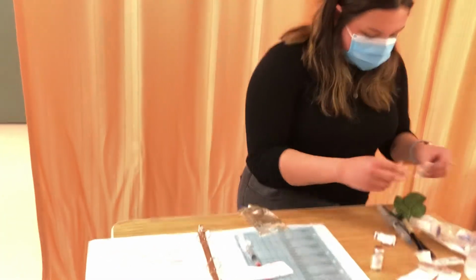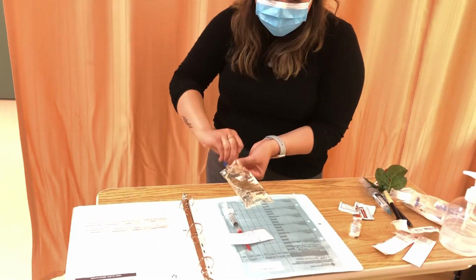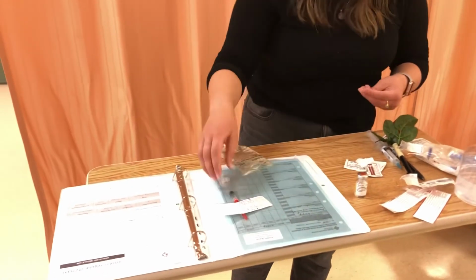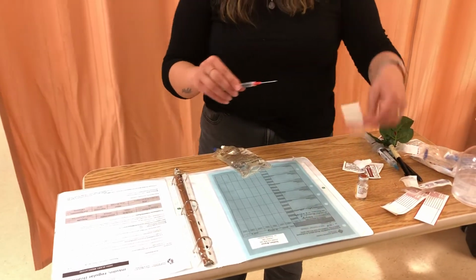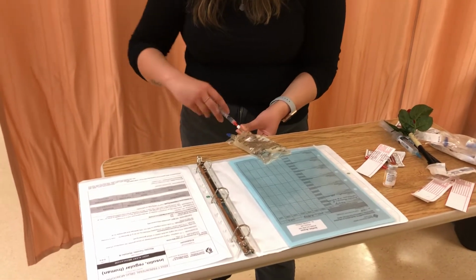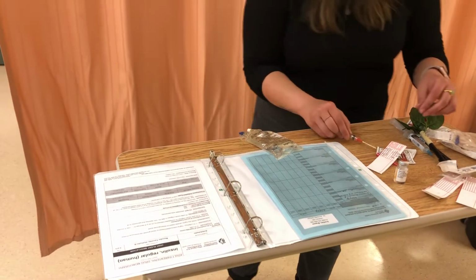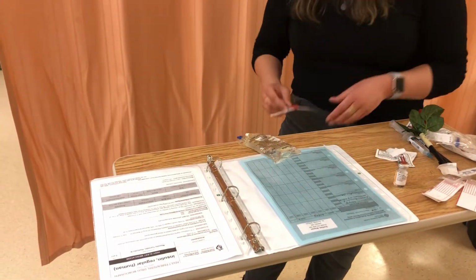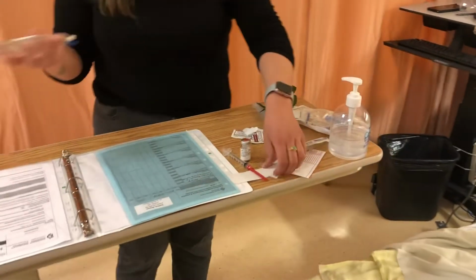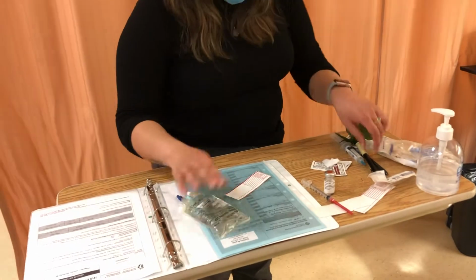So I'm going to go ahead and clean. I'll just close my... And I realized that I don't have enough saline on my syringe, but as you can see, the vials are both empty, so in a real clinical situation, this would have the correct volume of these vials. After this, this and my vial would go into med waste. So I'm going to lightly mix this, and I'm going to create a label for my mini bag here.